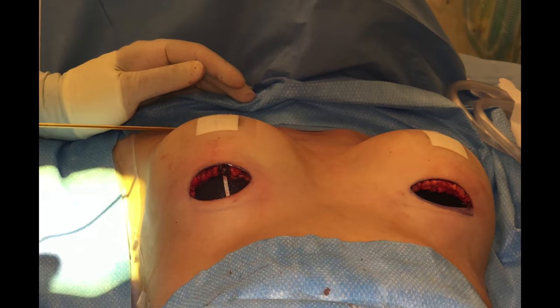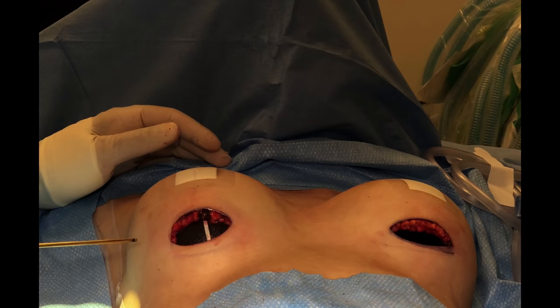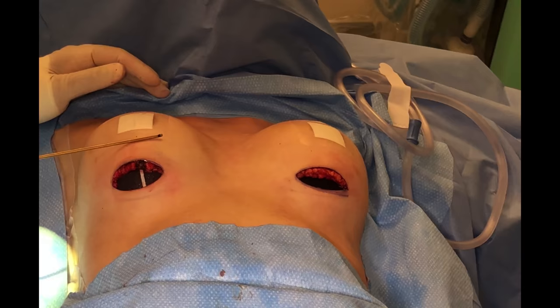The teardrop shaped implant doesn't have as much fullness here at the top. So where is that volume? It's down here at the bottom. What that means is that you're actually going to project more here with the shape than you are here.